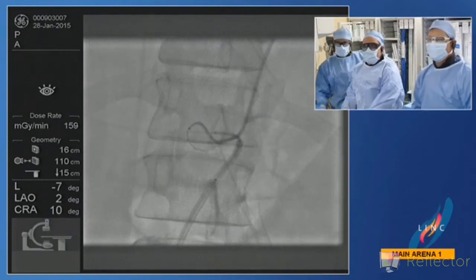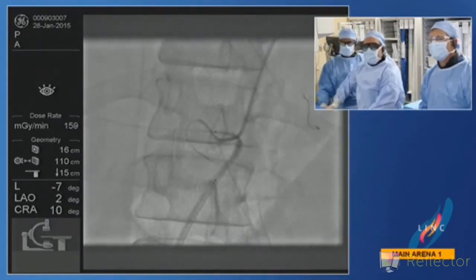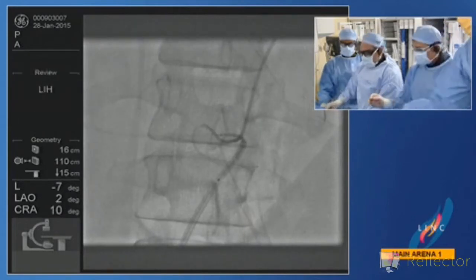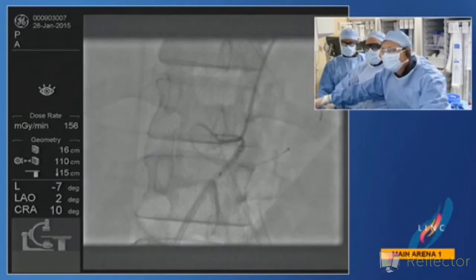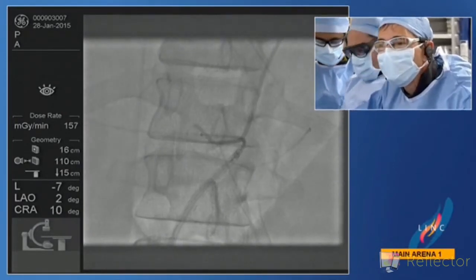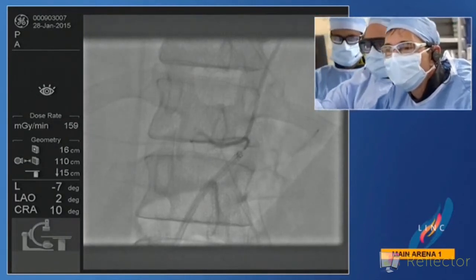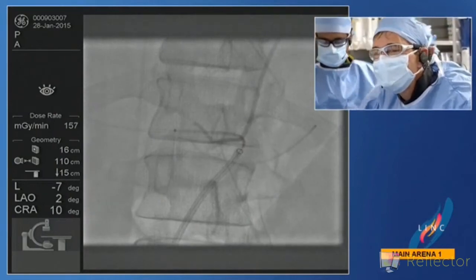And this 6 Viabahn, I think, is a real nice fit. There, we've got the splenic. Good. Micro down. We'll just confirm we're in the right spot. Let's advance a little more. I'm bringing up now the Viabahn. Make sure the morph is working great, so we're up pretty good here. 3 cc merit with contrast, please. Kicking a little bit, but not too bad.